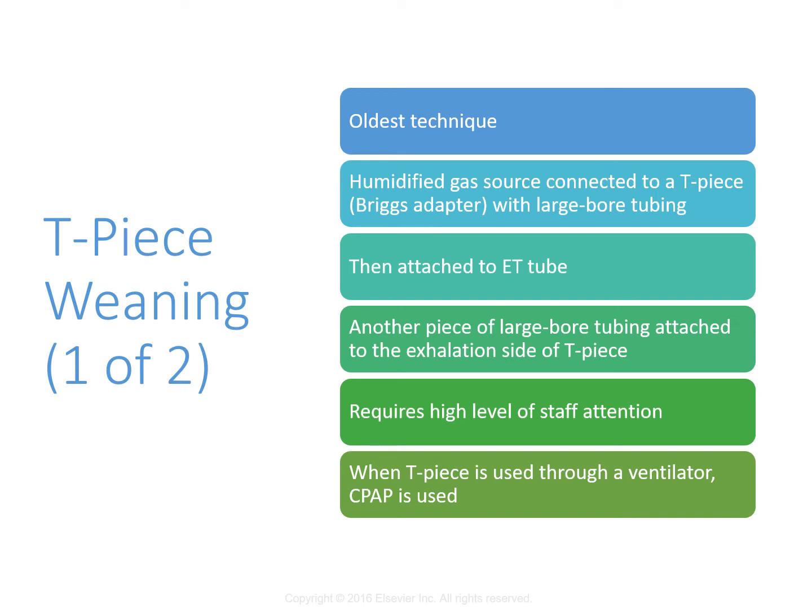with high flow rate. So we're going to hook up a heated venturi or heated aerosol to the airway and take them off for maybe 5 to 10 minutes and have them breathe spontaneously, and then we'll return them back to the ventilator for the remainder of the hour. So they used to do this once an hour, and then the time off the ventilator was gradually increased. So maybe it was 10 minutes this time. Well, maybe it was 30 minutes the next time, and 30 minutes off the next time, right?